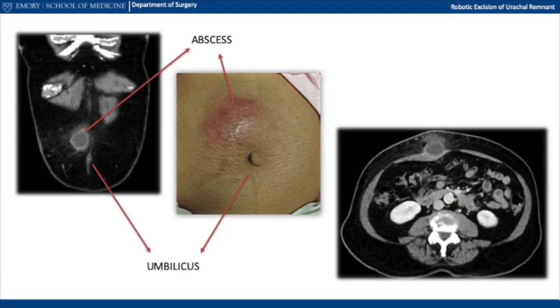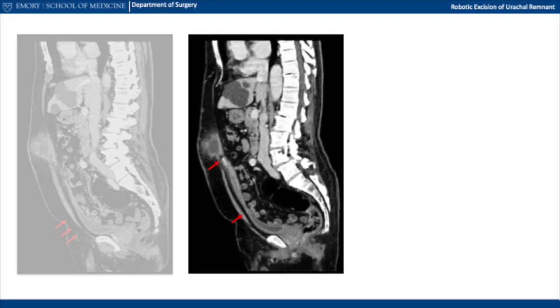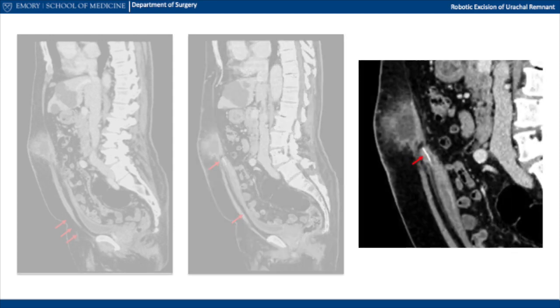Shown here is the external appearance of the abscess, as well as a CT scan demonstrating that it is completely extraperitoneal. The three arrows on this slide denote the top of the bladder on the CT scan, and in between these two arrows is noted the intra-abdominal portion corresponding to the urachal cyst. The single arrow denotes the calcification present between the abscess and the urachal cyst inside the abdomen.